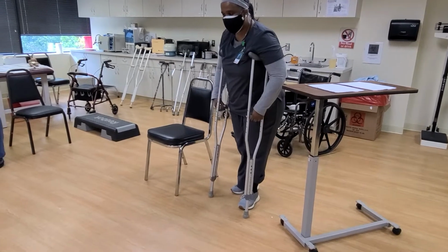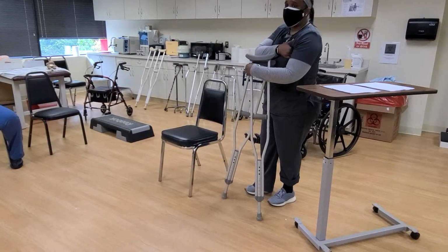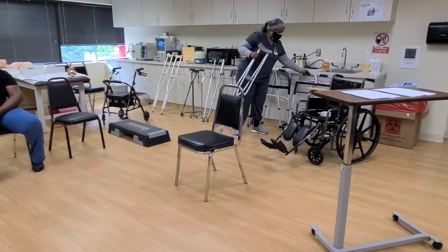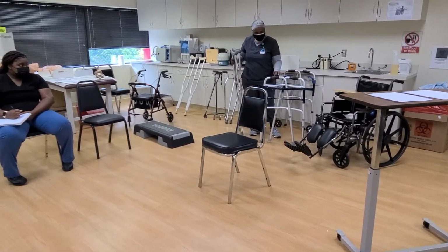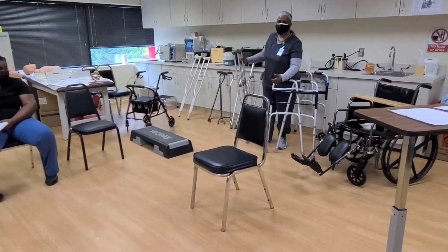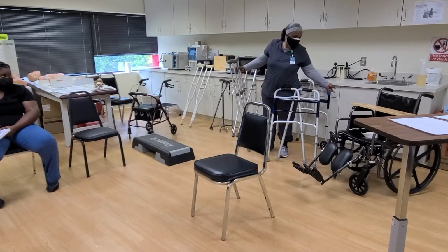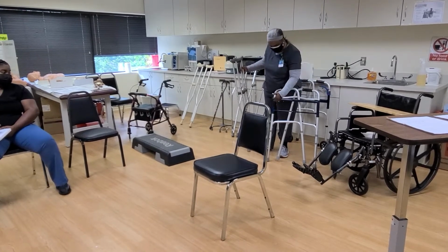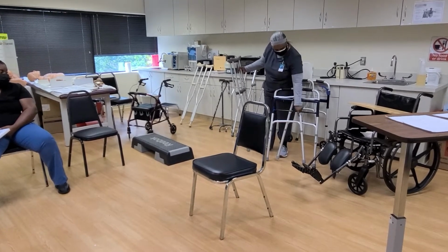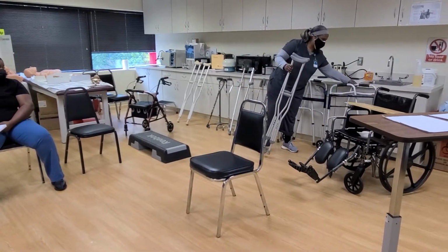Sometimes you'll see they'll cushion the hand grips, or they'll cushion underneath where the arm pads are, because if not, you can press that nerve and cause nerve damage. You'll see the same thing sometimes with the four-leg walker, they'll put more cushion here. Sometimes they'll cut a tennis ball because they want to drag it instead of pick it up. Well, the point of that is actually to get a four-wheel walker or two-wheel walker. But sometimes they'll do that because they're not walking with it properly, so they're dragging it, and the rubber will wear out, but you can replace the pieces, okay?